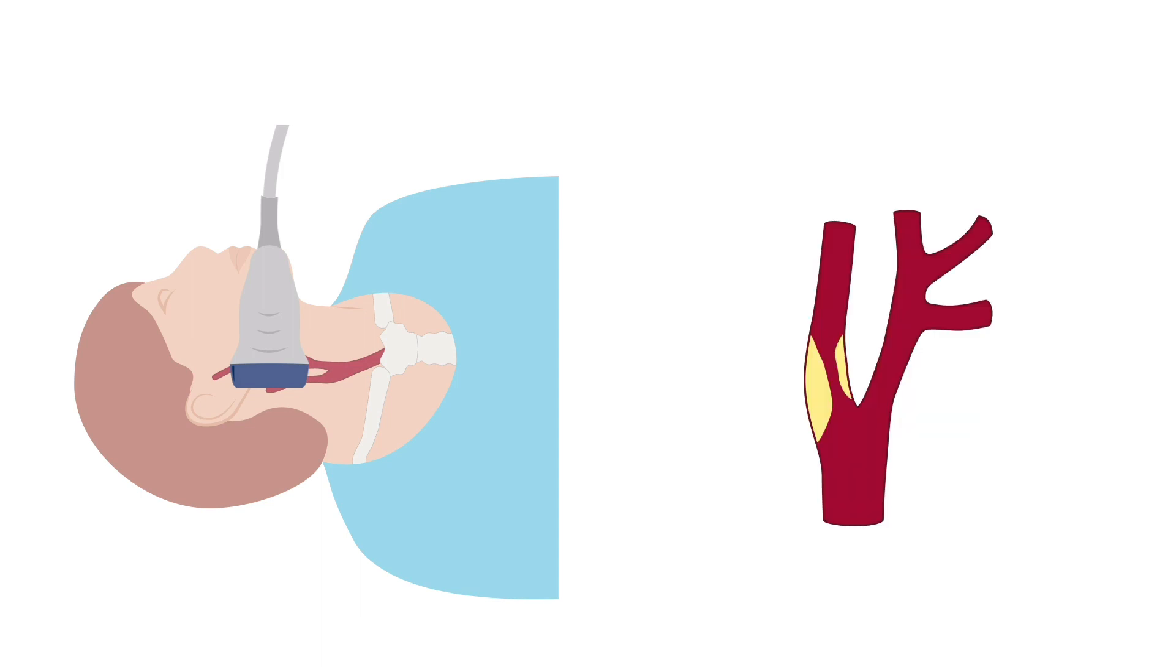If significant disease is identified in the ICA, it is really important to image as high up as possible into the distal ICA to confirm that it is patent or unobstructed and of good calibre.